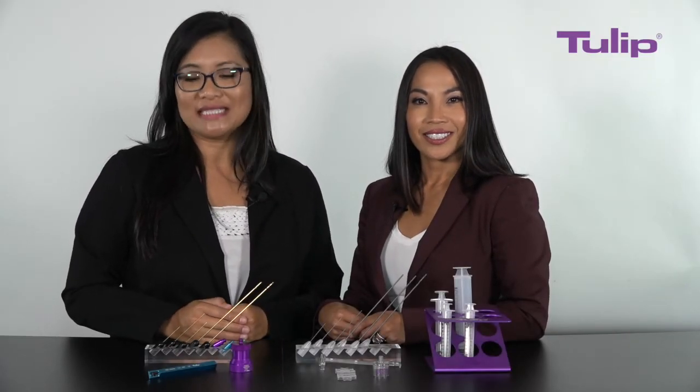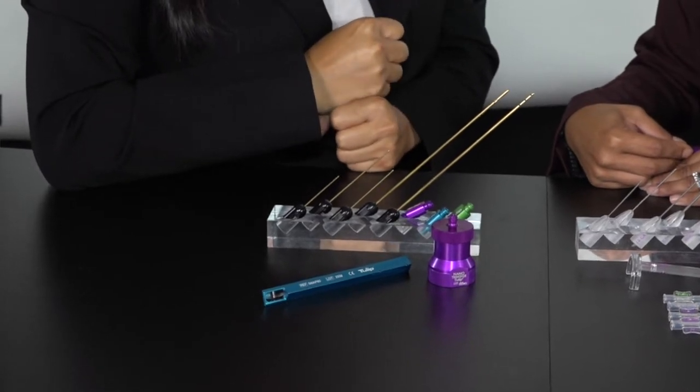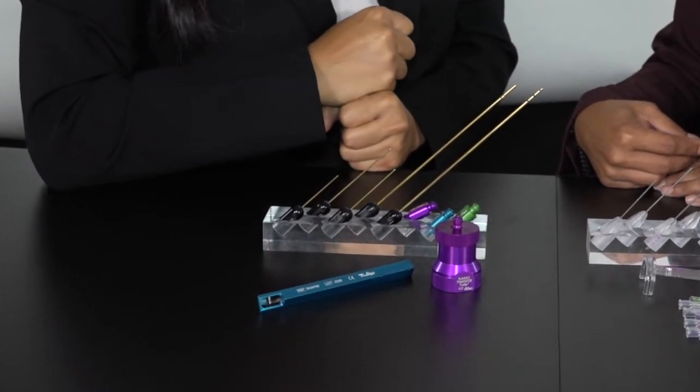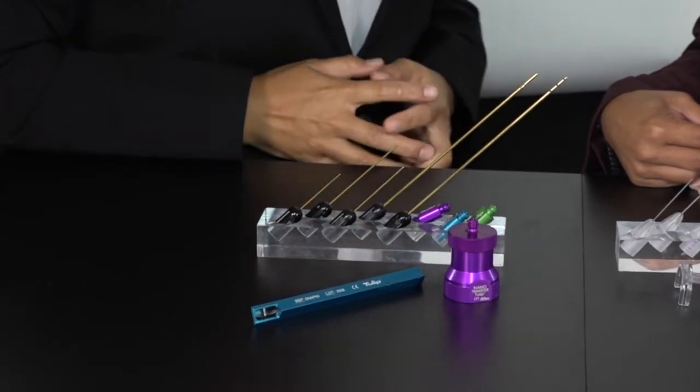The next set is our reusable Tulip Gold Standard Miller set with the Generation 1 Nano Transfer Set. This entails a single solution set as well, whether it's in office or in the operating room. It's similar to our single-use set, but you can autoclave and reuse it up to 50 times.